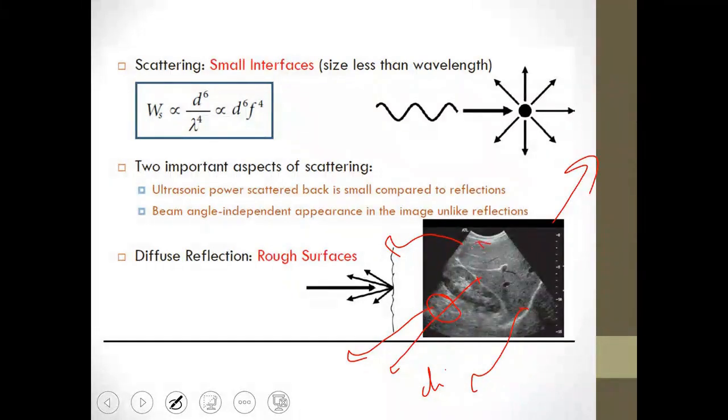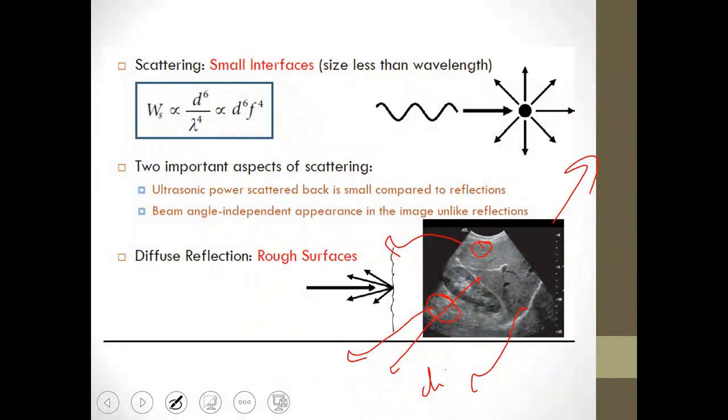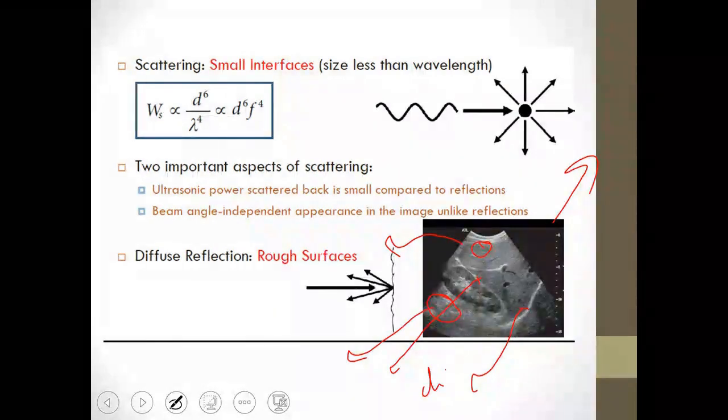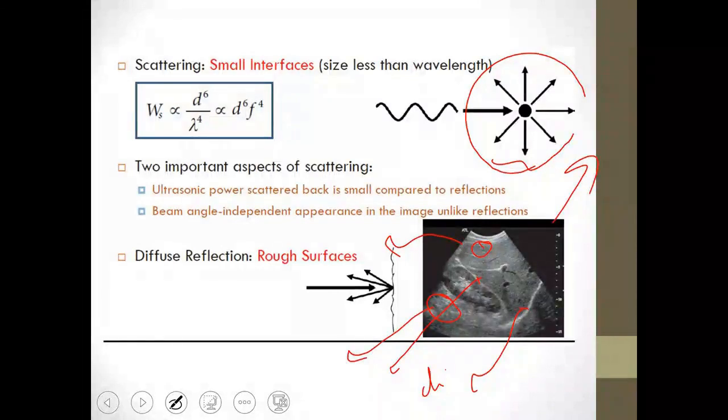This first one, which is number one, is a homogeneous image, or what is called the echo texture of the ultrasound. This occurs because the ultrasound pulses, as they descend, encounter the hepatocytes, which have a certain size smaller than the wavelength of the ultrasound pulses. Thus, isotropic scattering occurs in this manner, giving you the appearance you see in the received signal. So, this is number one.